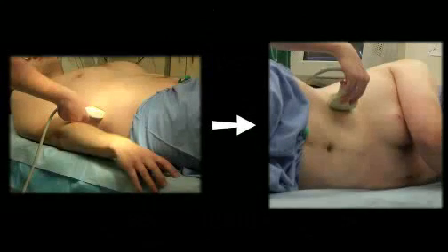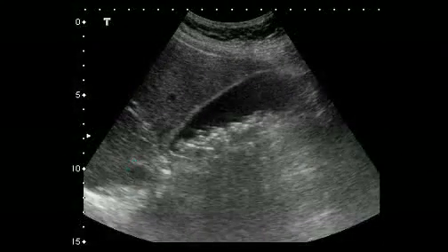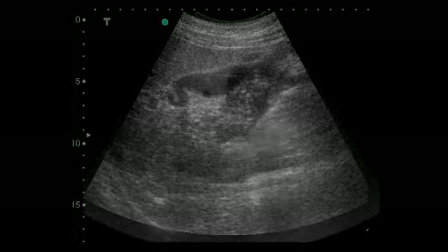Gallstones in the gallbladder generally appear as hyperechoic structures with significant shadowing. If they are not impacted in the neck of the gallbladder, having the patient change position should show free movement of the gallstones. Gallstones range in size from small to golf ball size. Smaller stones are more likely to cause symptoms by becoming obstructions. Polyps and valves of Heister may be misidentified as gallstones.